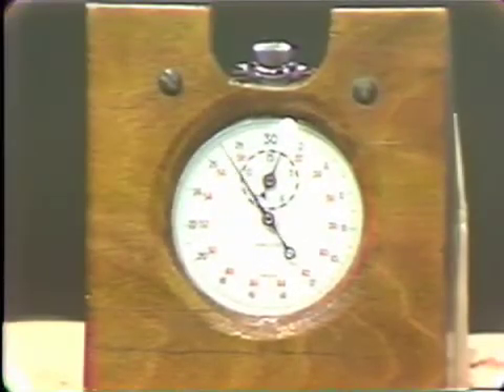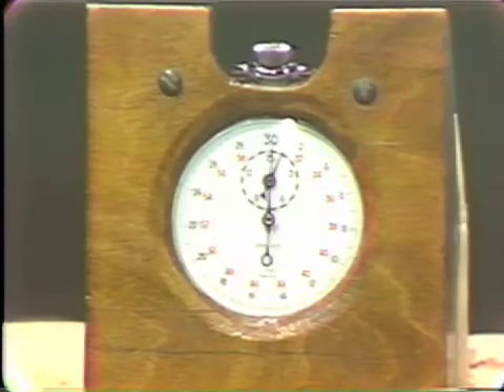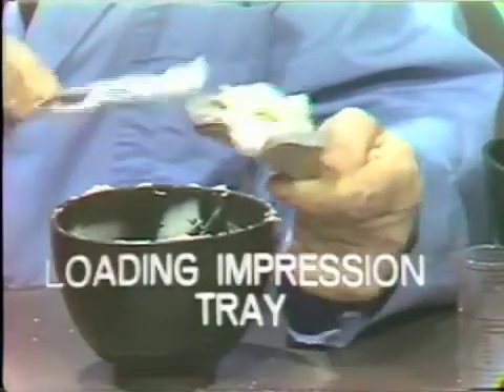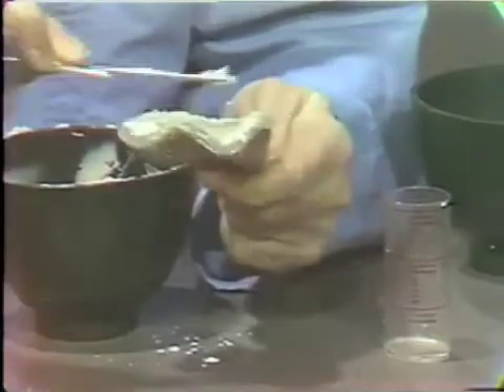The material can be collected from around the sides, and you can see that with this technique you should get a nice, smooth, creamy consistency. Now we should be approaching the one-minute mark. We will collect the material and place it in the impression tray. It's advisable to start from the posterior and add the material, then spread it into the anterior region.